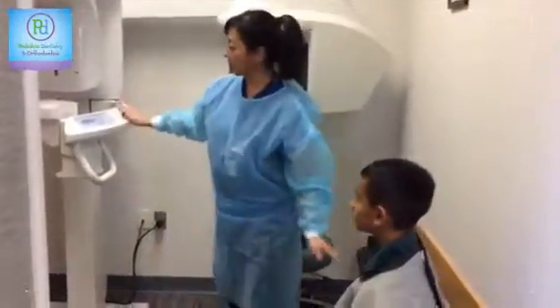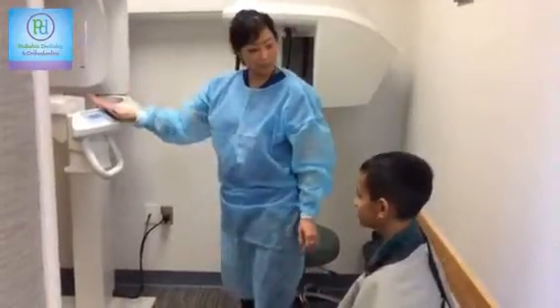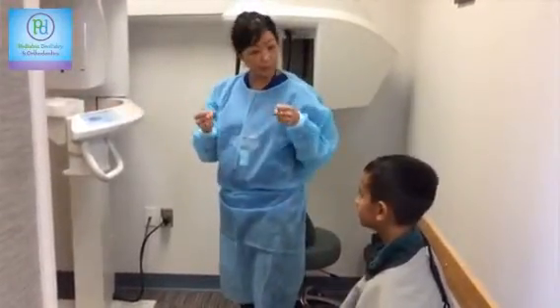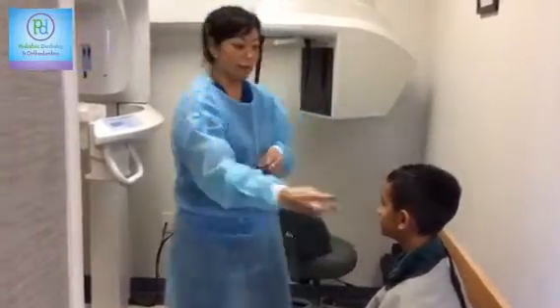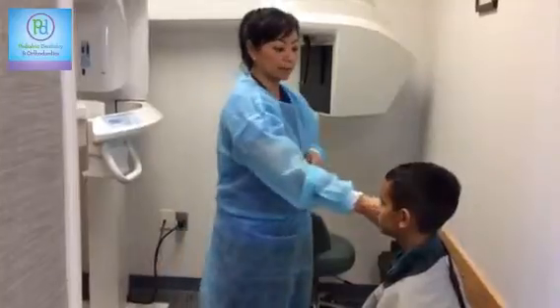This machine is called our panoramic machine. It spins all the way around and it's going to show us everything from all the way around, from ear to ear.